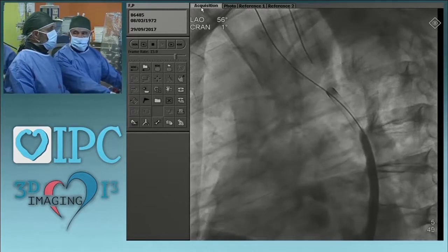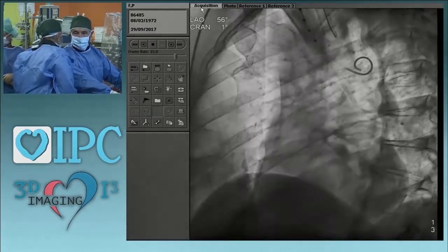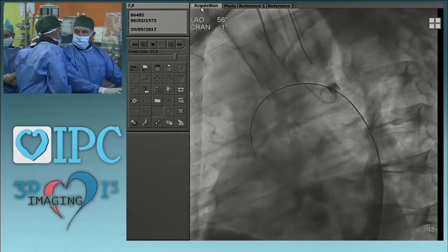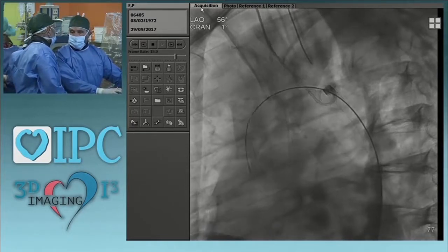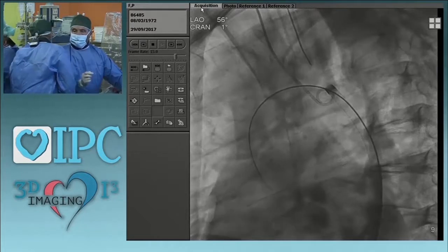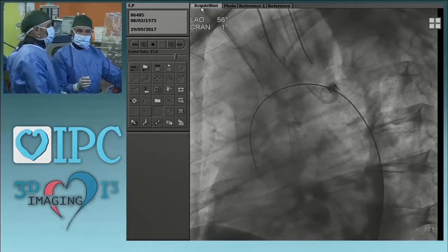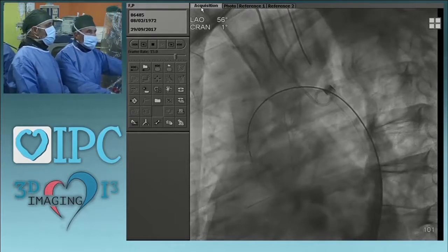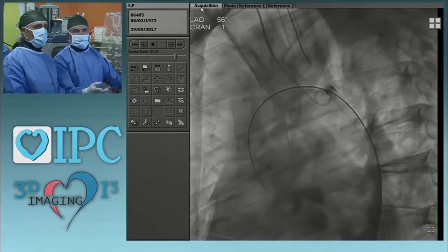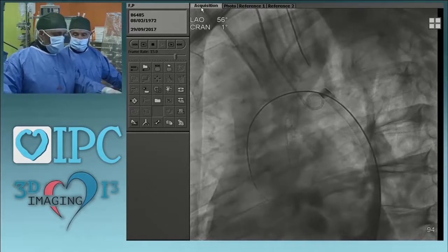Yeah. Can you hear me, John? Can we hear Mario? Yeah, can you get Mario's mic to work better, please? Right. So, since you put a 14 French sheath in, I'm assuming you're probably going to put the NewMed covered stent in. Is that correct? Just with the sheath size, or are you considering the Advena? We don't have the full. We selected. Yeah, Mario's mic's not working.